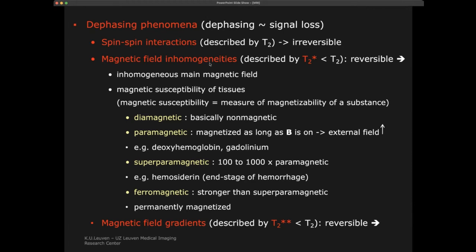Now, when we look at the dephasing in the XY plane, there is the T2 relaxation that's happening, and the T2 relaxation is because of inhomogeneities in the magnetic field because of surrounding different molecules. Because we have locally different molecular environments, and each of these molecules is a little magnet, the total magnetic field there locally is different. Because of that, we get a different frequency, and then we get the dephasing, and that's the T2 effect. That's happening, we cannot do anything about it.